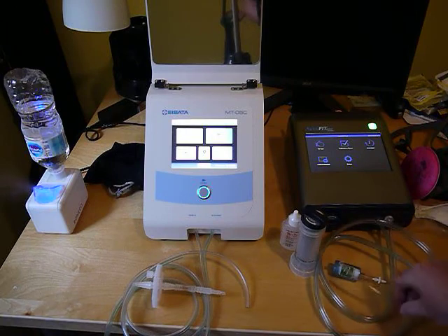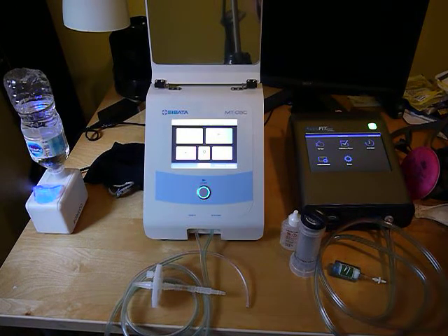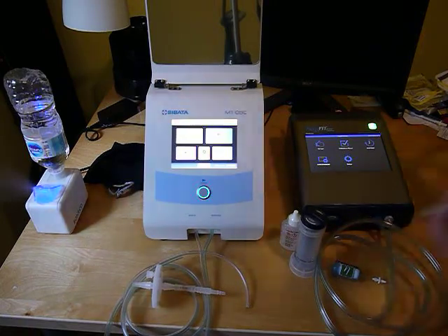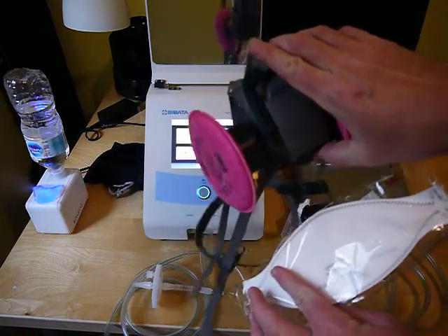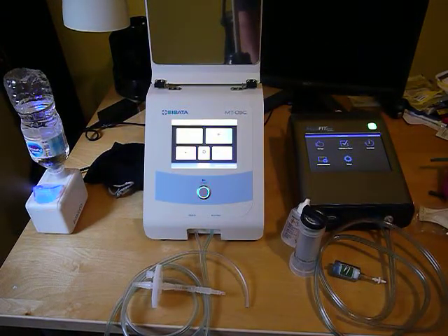Another thing to make sure is the pass levels. For N95 or half face respirators, the pass level is 100. For full face respirators that are not SCBA, it's 500. If you're testing SCBA, it's 1,000.